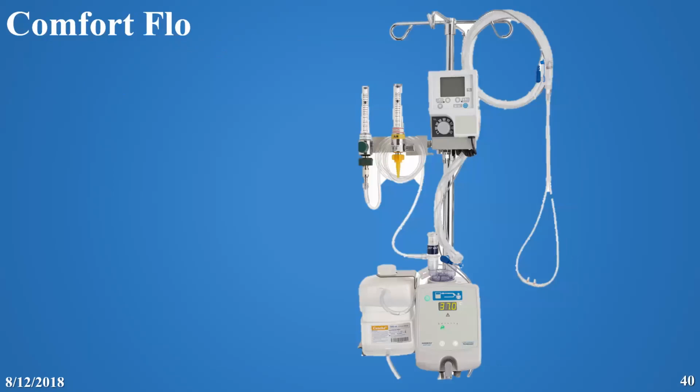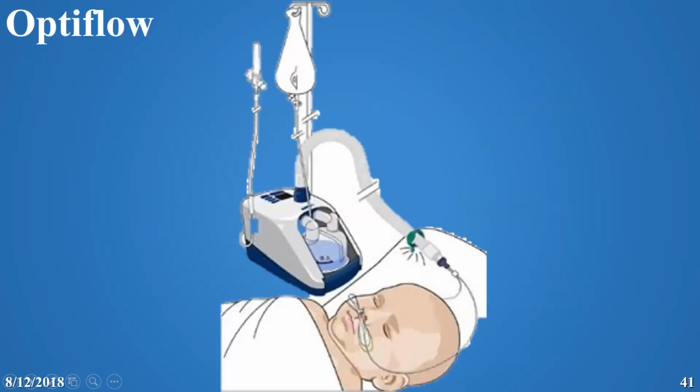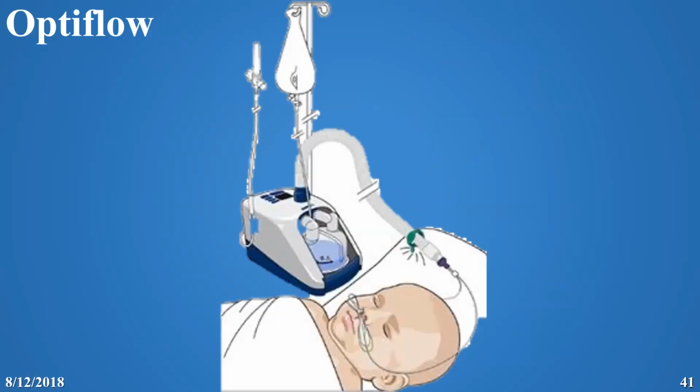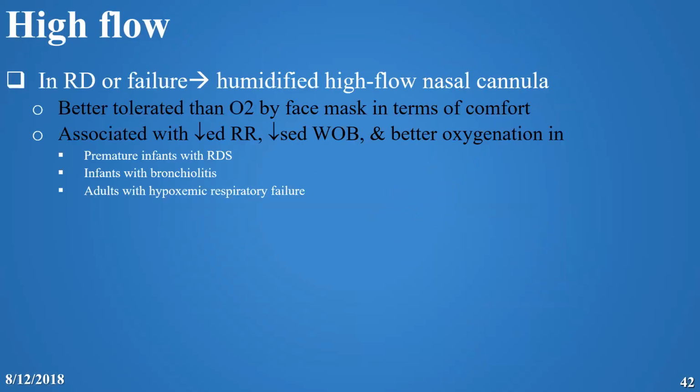We have the Comfort Flow. Again, you see that the machine is here, the humidifier, and you can see also the blender and the panel that shows you the measurement, and you can see the nasal prong and the humidifier. There is another one called OptiFlow, so not much difference from that.